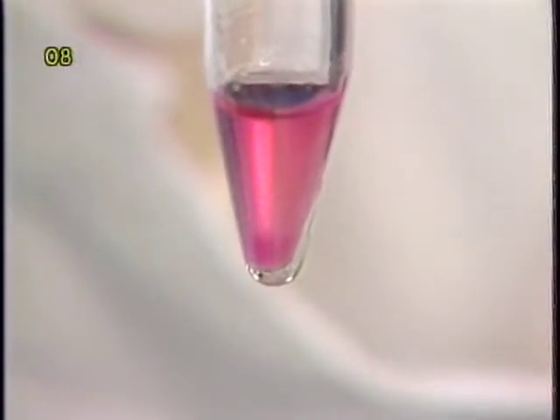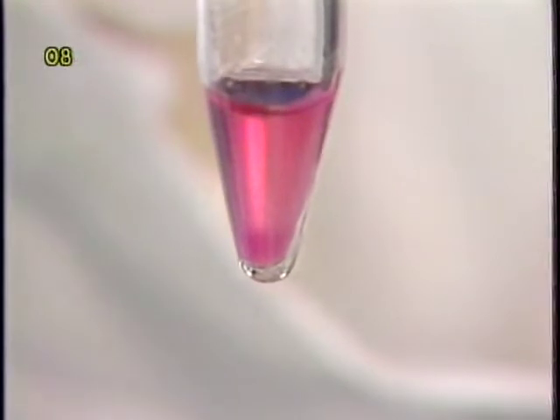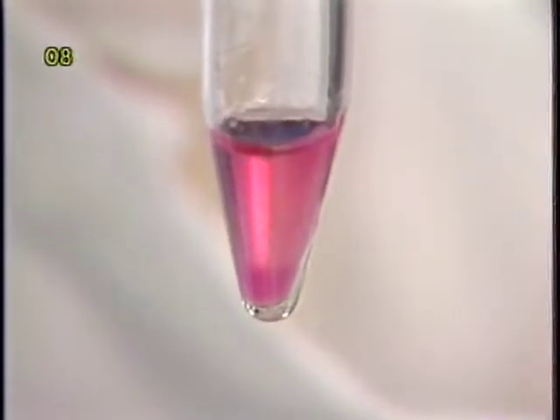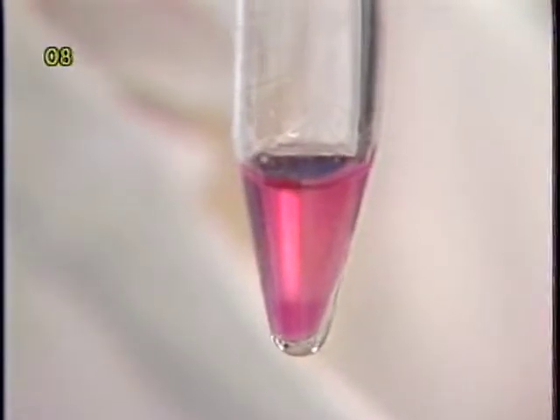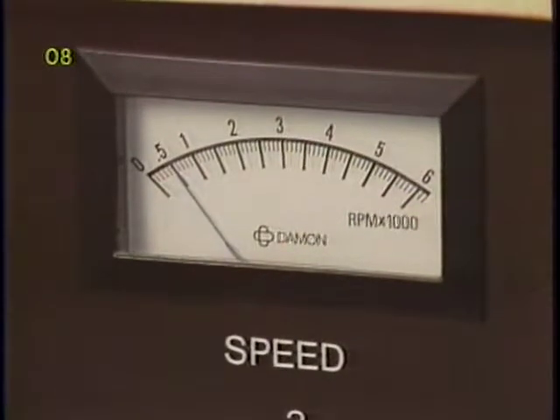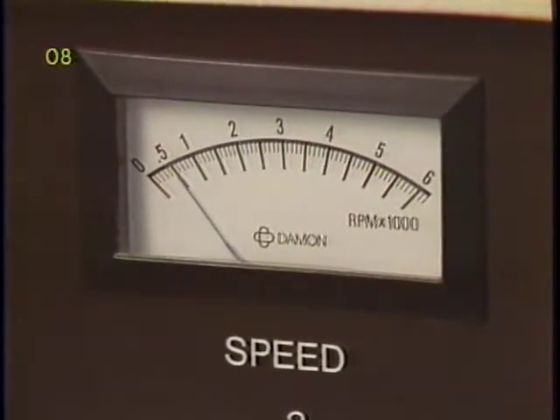However, the boundary between the supernatant and the microcarriers is usually not sharp, making subsequent removal of supernatant a bit difficult. By centrifuging at about 500 RPM for 30 seconds to one minute, a packed bed of microcarrier beads is formed at the bottom of the tube.